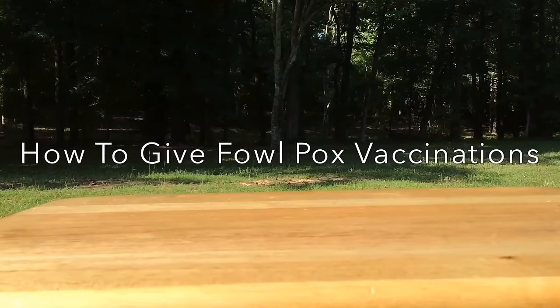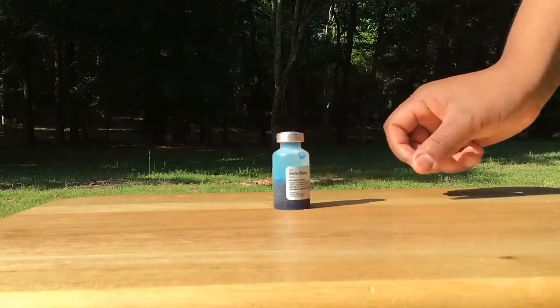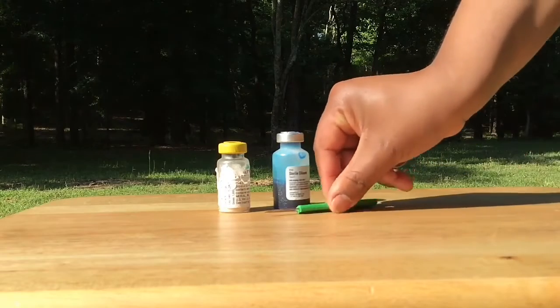This video will explain how to perform the Fowlpox vaccination in order to help you keep your flock healthy. When you buy Fowlpox vaccine, it usually arrives with a bottle of diluent, the live vaccine, and the applicator stick.